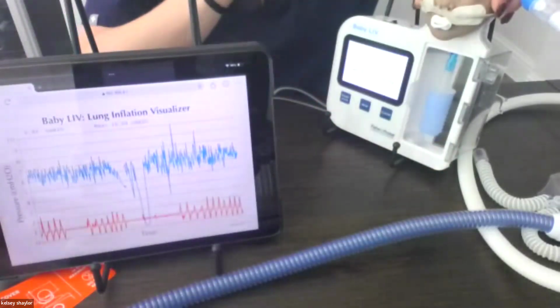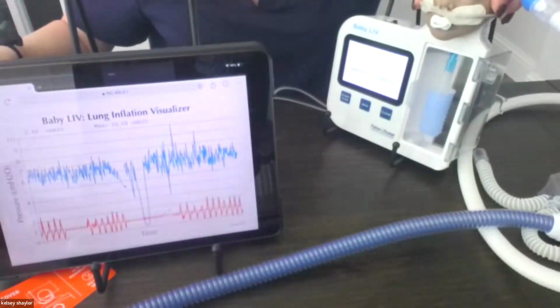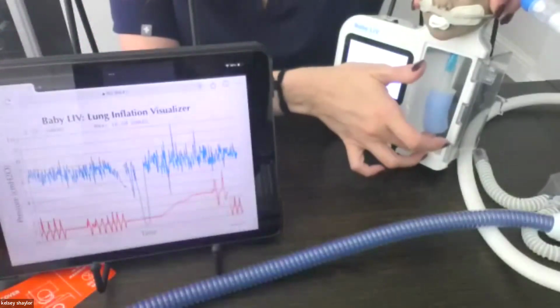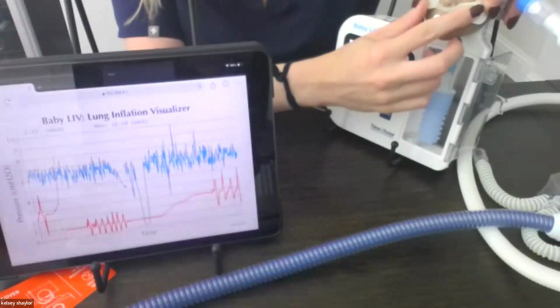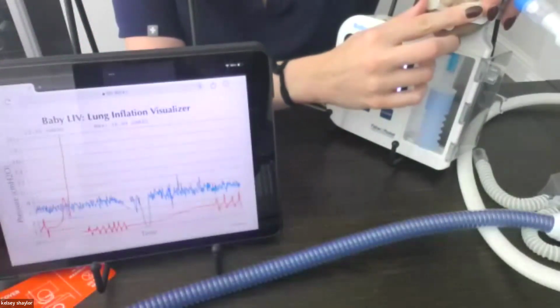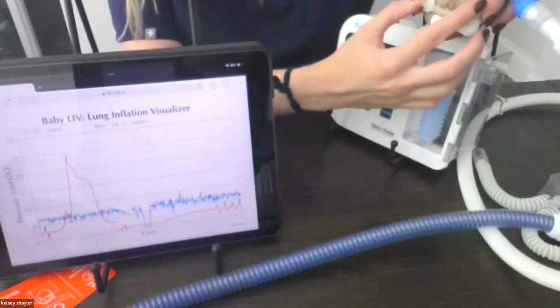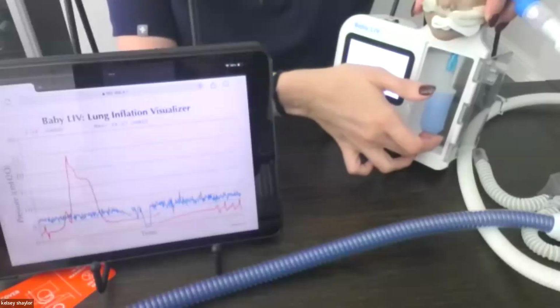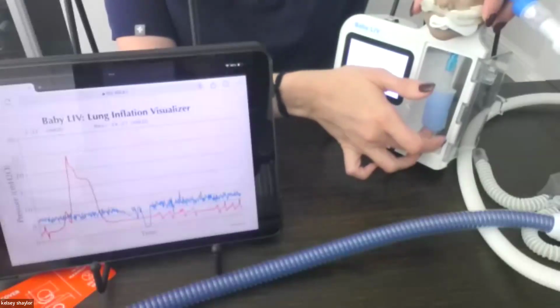And so if we're delivering high flow, it's really important to use enough flow to actually get those benefits of the therapy. And so I'll turn that up just a little bit. So again, to remind you what 6 looked like, we stayed up here. And at the beginning, when I had the cannula way too far in the nose, that's when we run into some issues, right? Because that baby has nowhere to exhale. They're probably going to spit out their pacifier, open their mouth, right? This baby doesn't have a tongue, so I have to keep a pacifier in to kind of give you an idea of what it could look like.